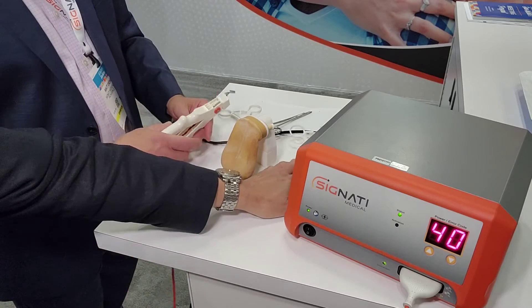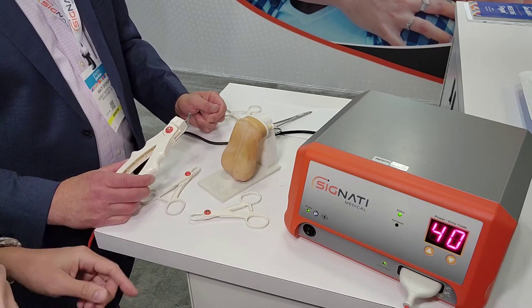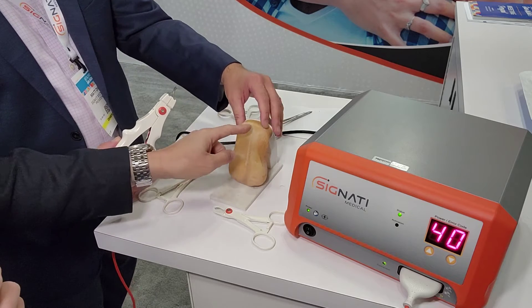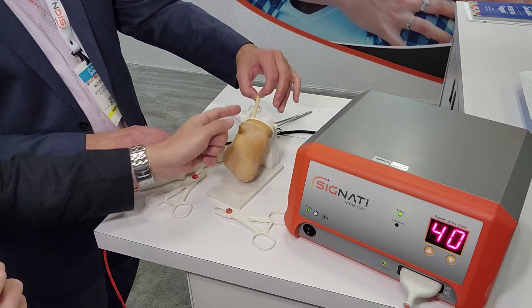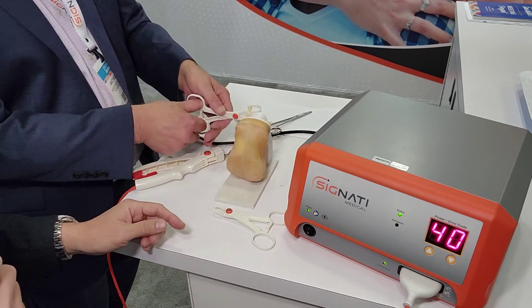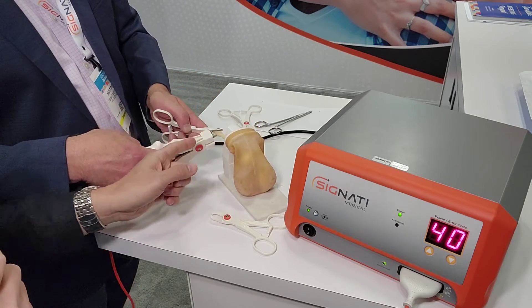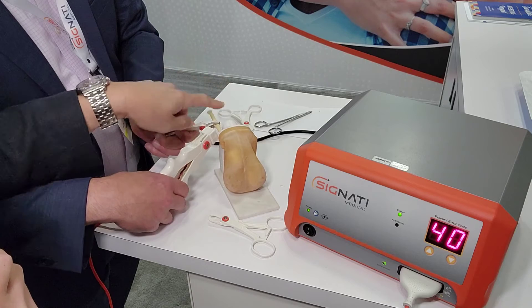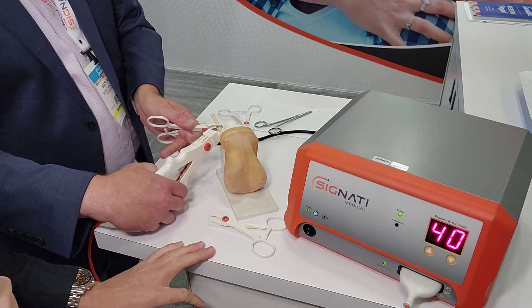The kit comes with two plastic clips, just in case you drop one or want to use a new one for each side. You can do it transdermally, or if you're a traditionalist, you can make a tiny puncture in the midline, bring the vas through the skin, and perform the same technique. Encircle the vas — and this is probably a better view — you can see the vas right there, then the clamp, then the RF delivery device. Press the pedal, divide the vas, and seal the vas the same way.